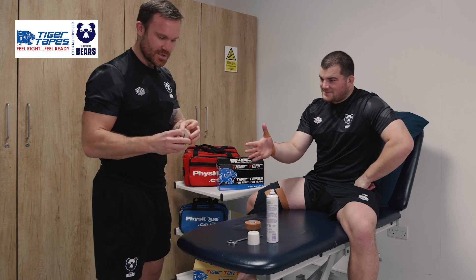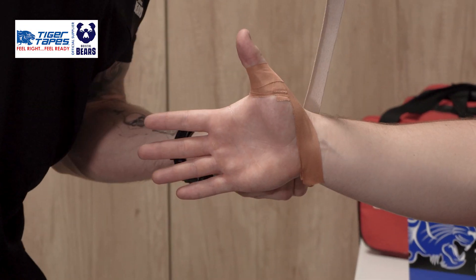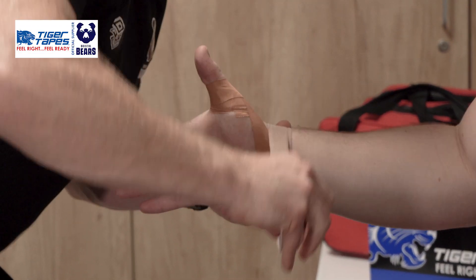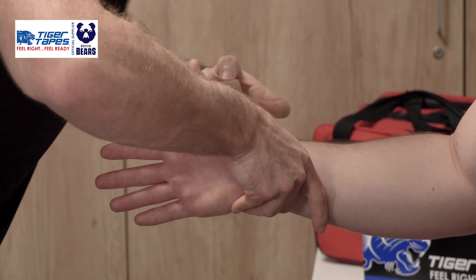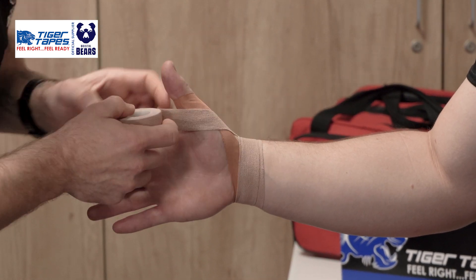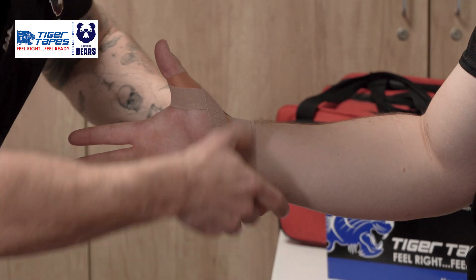Base done. We're then going to use the 2.5cm EAB just to lock that off. Starting this time coming around the wrist, locking in our Tiger Tan Tape, two rotations through, and then we start to cover that thumb, starting around the base of the thumb like so, passing back down the wrist.